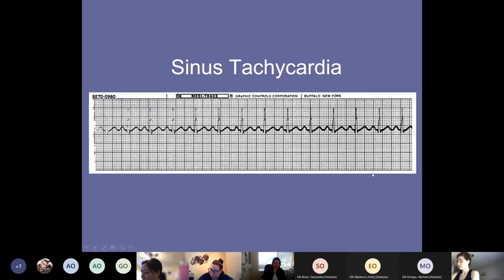Supraventricular tachycardia, this is a hard strip to see. We do realize that it's hard to come through, but basically supraventricular, oh, I'm sorry, did I say supraventricular? We're on sinus. See, I just made my first mistake, and mistakes are okay here, not on the test, right? So it's sinus tachycardia. It's still a sinus rhythm, Michael. It's got that P wave before every QRS coming from the SA node, but the rate is greater than 100. Our rate is 140 here. What do we do for this patient?